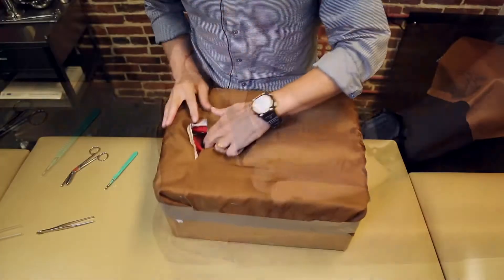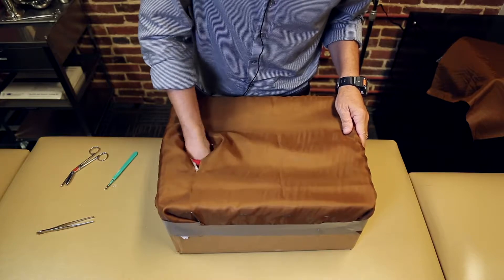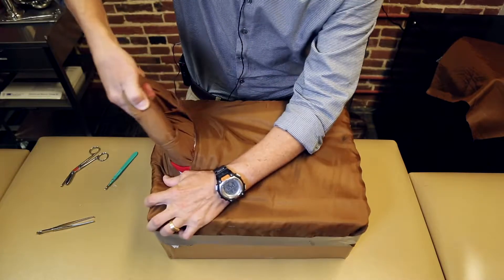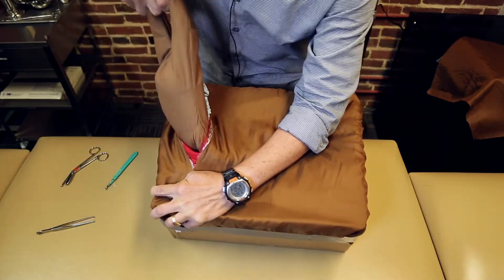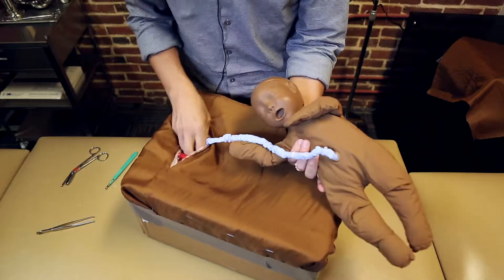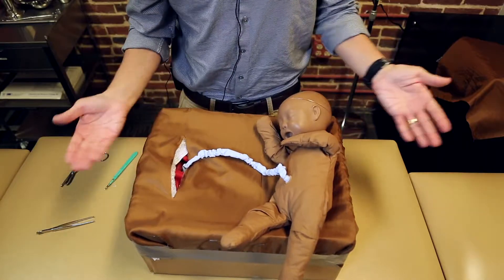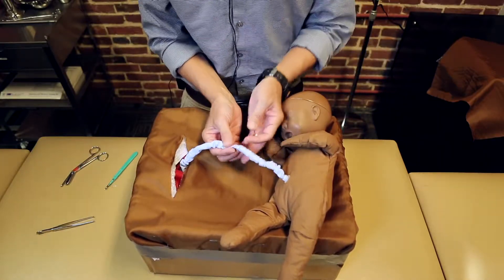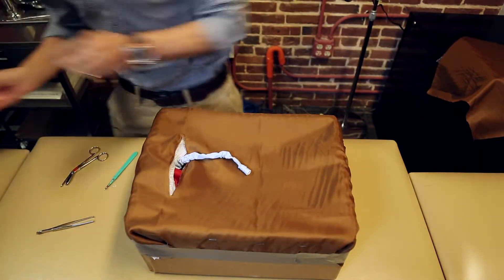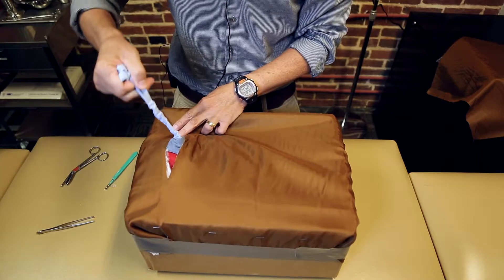In this case it's a breech delivery, so I put my hand in, find the legs, and we deliver the breech. Then we do delayed cord clamping for at least 60 seconds. After 60 seconds, go ahead and clamp the cord, pass the baby off, and deliver the placenta with controlled cord traction.